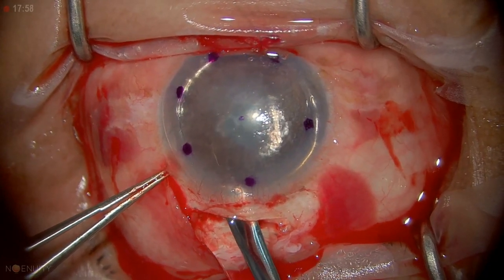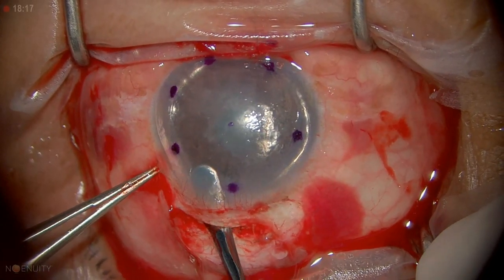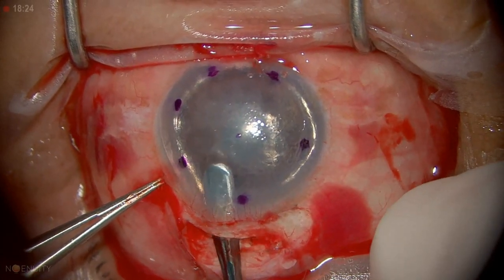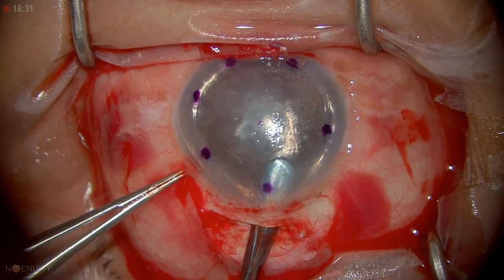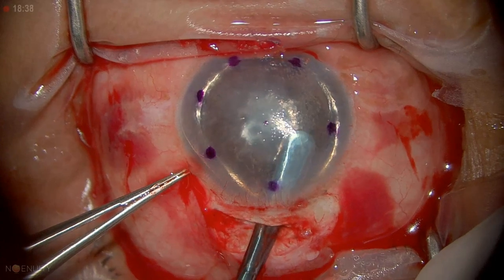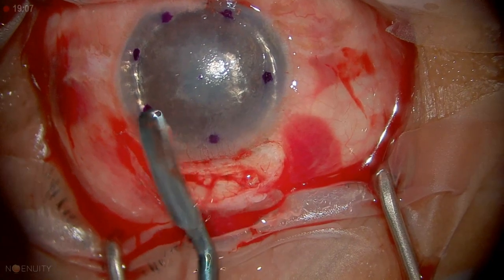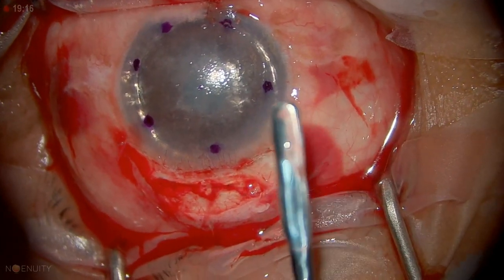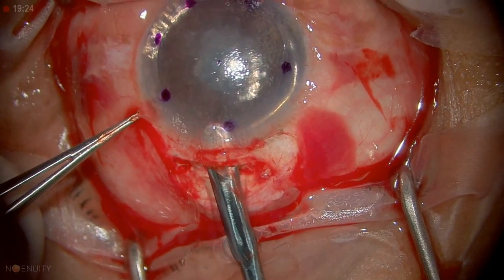Now I'm in the right plane and just dissecting. It's fairly easy — you can see how nicely it moves, very smooth. You're making little micro movements and watching to make sure the pressure stays high. The trick is you have to keep this flat and respect the curve of the eye. If you start to lift up, you're pushing down like a pedal and you end up getting a perforation. We're about halfway through the dissection.